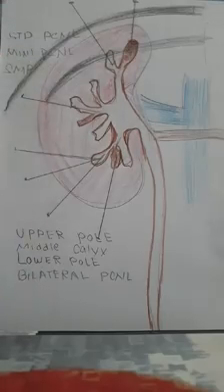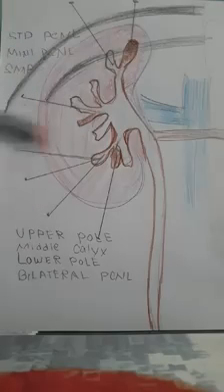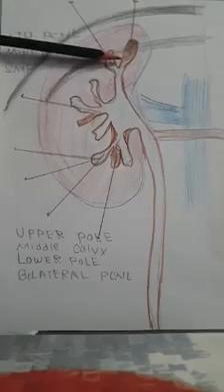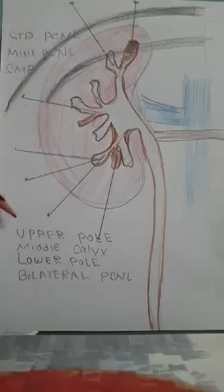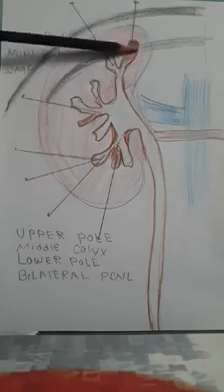I have been doing bilateral PCNL for 6 years, and it is very possible to do a bilateral PCNL from one side. Let's suppose I'm doing a bilateral PCNL from the right side. My preferred approach for bilateral PCNL is always the upper pole, because I always do my bilateral PCNL from the same side. I don't change the position, because you know changing position is such a hurdle. So I approach the upper pole, and on the contralateral side I also approach the upper pole.